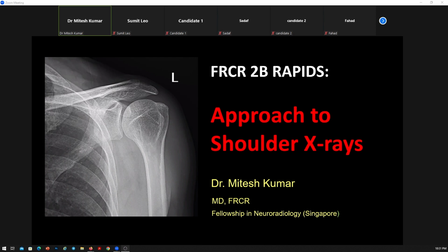at the specified time. Okay, good evening, everyone. My name is Dr. Mitesh Kumar, and today I'll be talking about approach to shoulder X-ray.